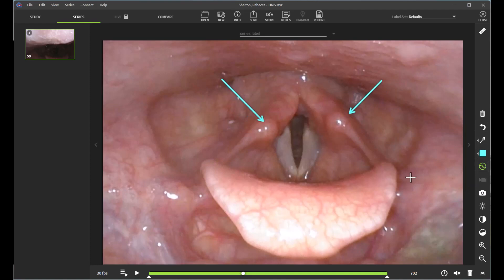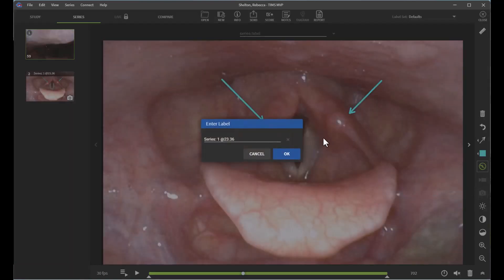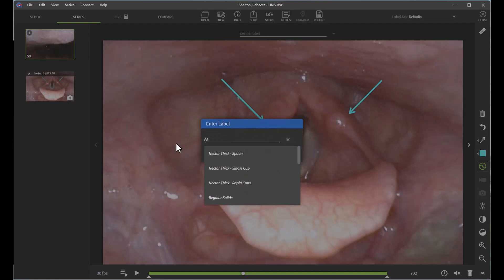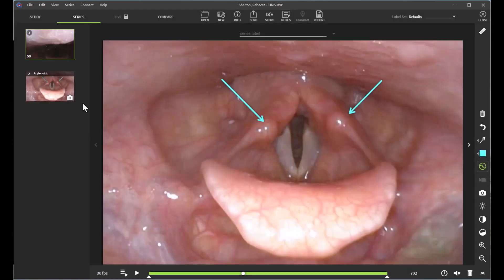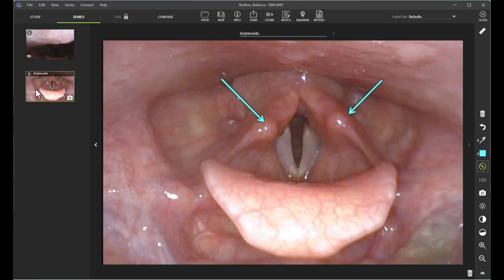If I want to take a snapshot of this to include in my report, I can easily do so by clicking the camera icon, labeling it, and clicking okay. And now you can see that my snapshot is here.